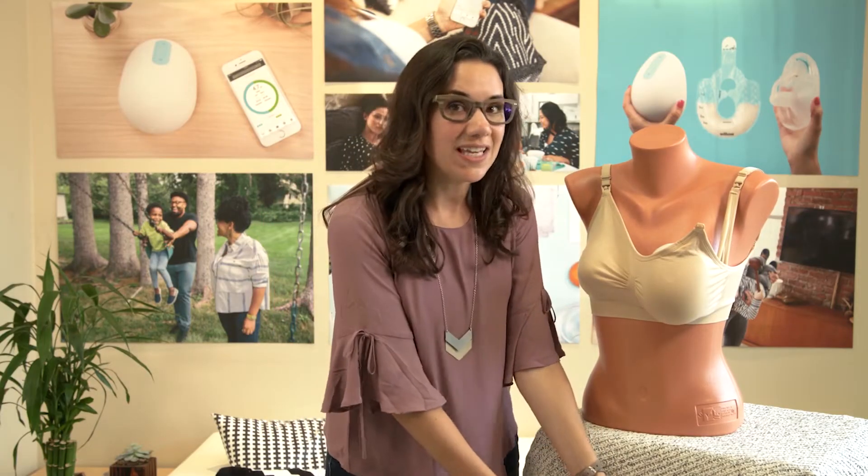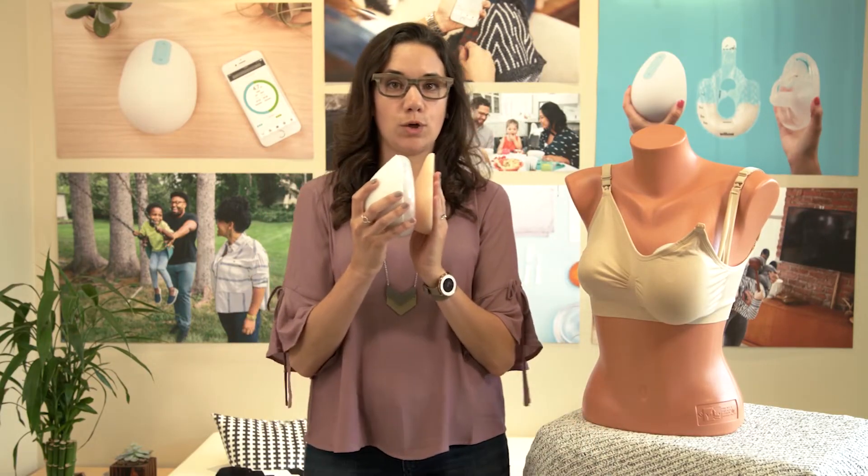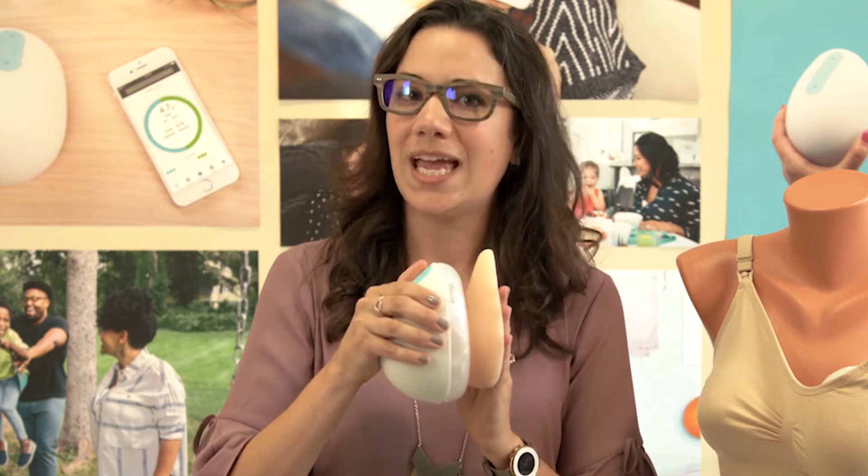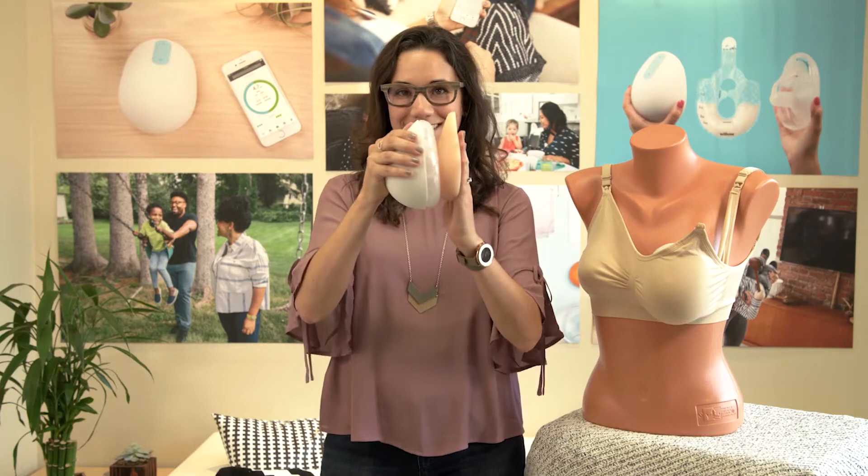The second is to eliminate any gaps between Willow and your breast. When in doubt, press Willow firmly against your breast, focusing on the top and sides. You want that nice seal.